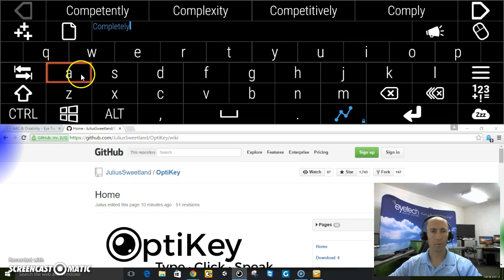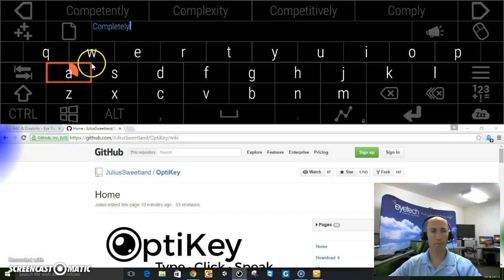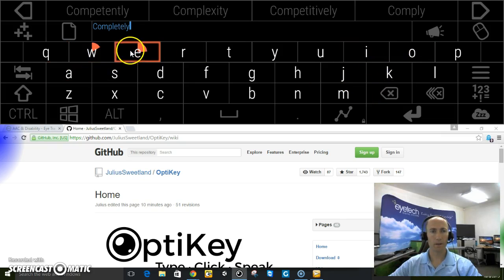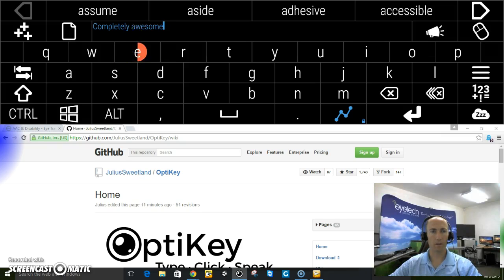And then I'm going to type awesome. Select the A and then end on E. Awesome software.